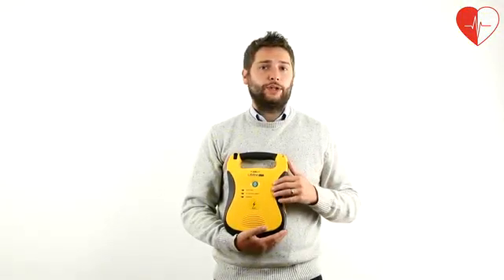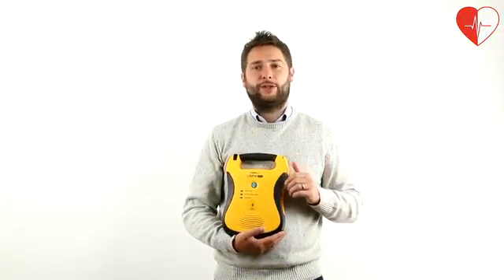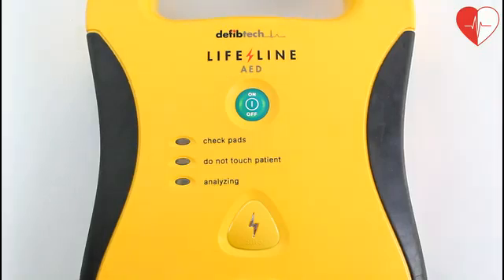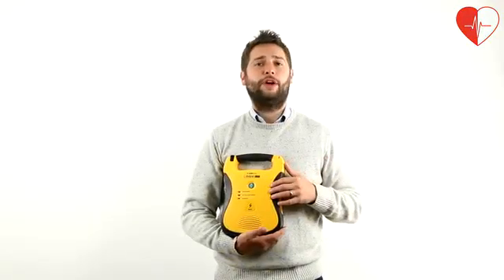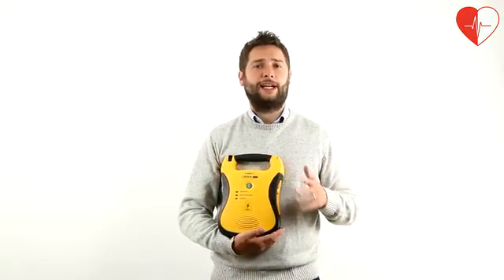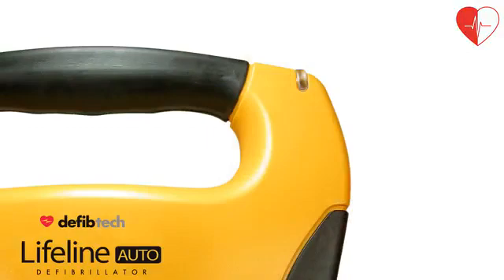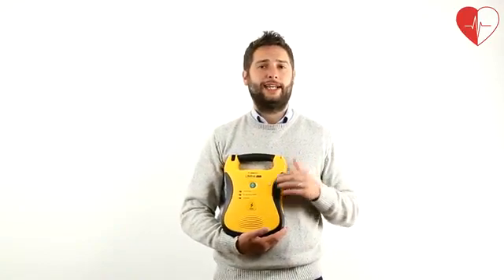The Lifeline Auto Defibs also feature CPR guidance and a CPR metronome. Fitted with a separate 9 volt lithium battery, the DefibTech Lifeline AEDs carry out a daily self-test and display the unit's readiness on the LED status indicator. All event data is stored on the defib's internal memory and can be downloaded onto a PC for analysis.